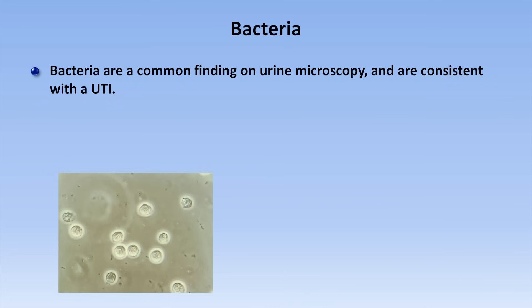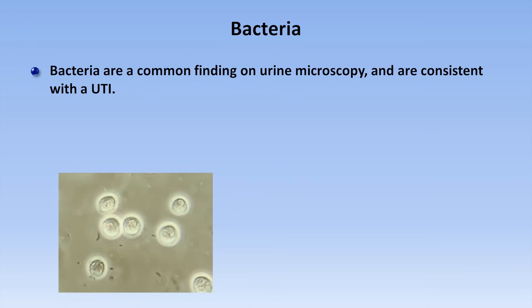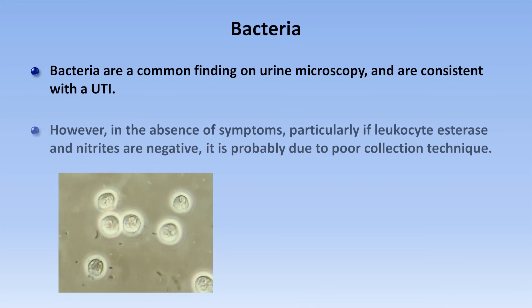Bacteria are a common finding on urine microscopy and are consistent with a UTI. You can see the rod-shaped bacteria as the tiny elongated shapes next to the white blood cells. However, in the absence of symptoms — particularly if leukocyte esterase and nitrites are negative — the presence of bacteria is probably due to poor collection technique.